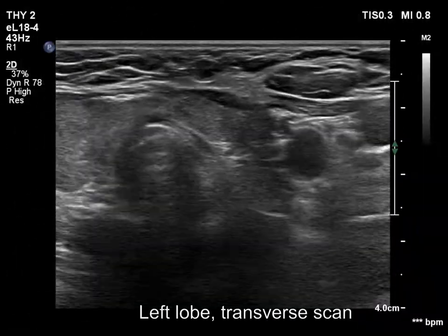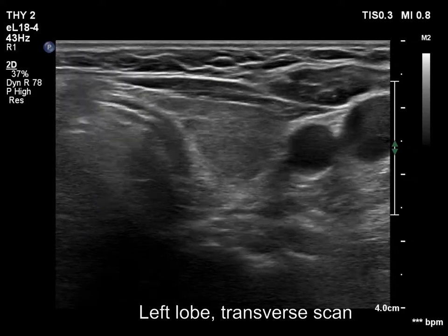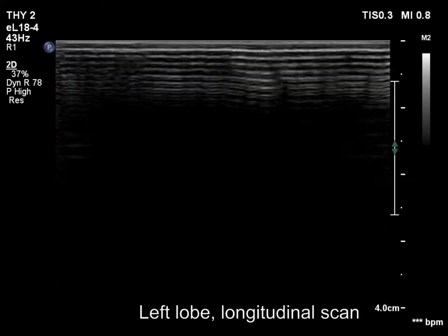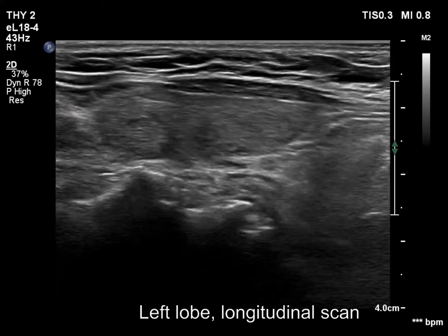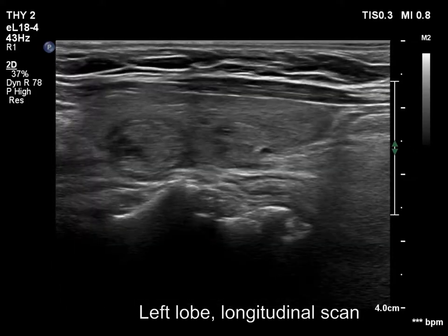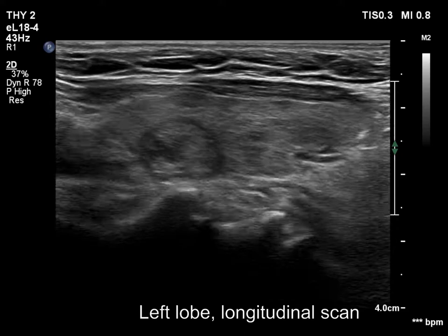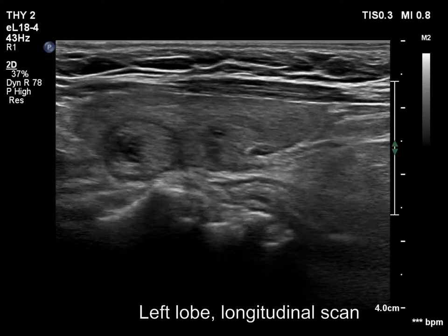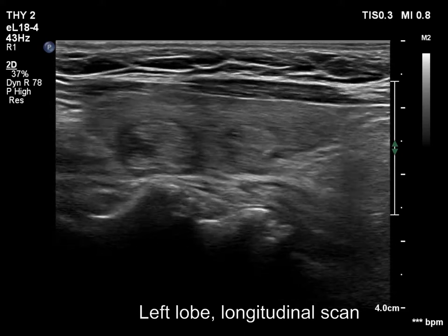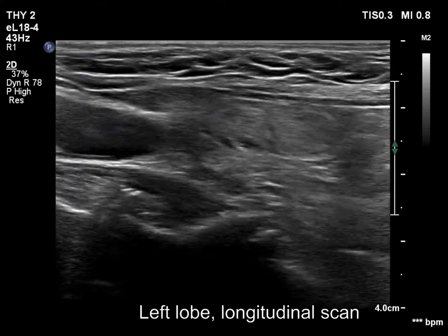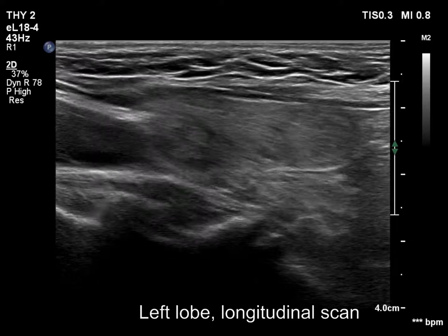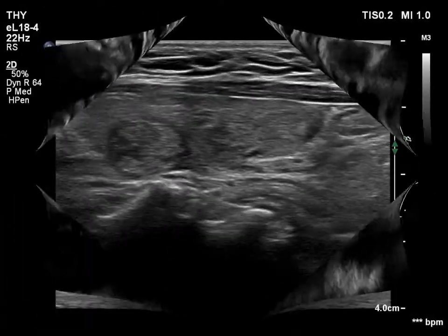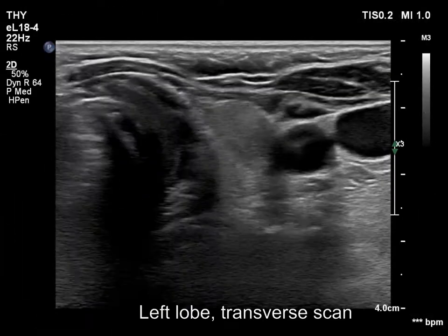The left lobe also has discrete lesions. These belong to the isohyperechoic subgroup because the minority hypoechoic parts do not form a lesion which corresponds to a pathological nodule.